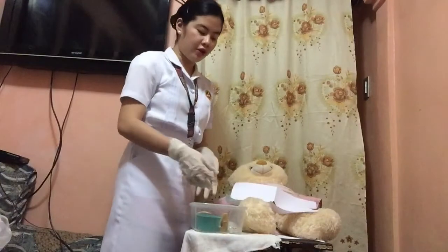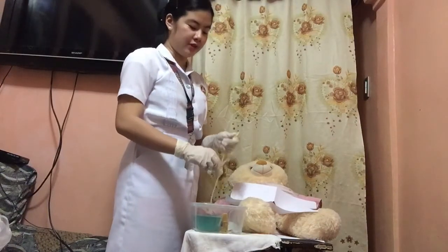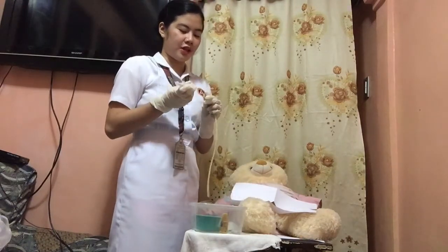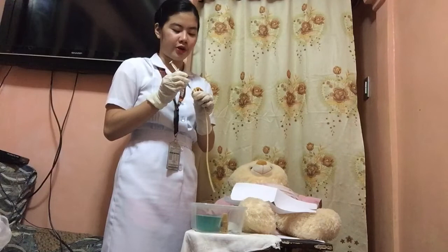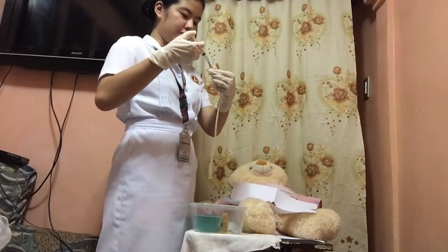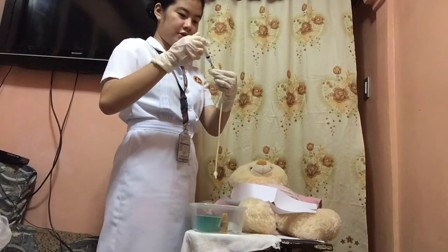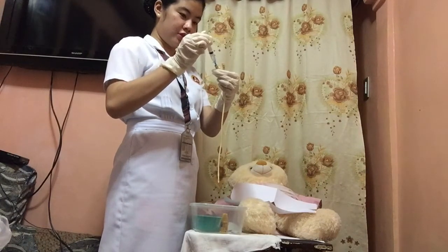Open all supplies. If the catheter is to be indwelling, test the catheter balloon: remove the cap on the tip of the syringe, attach the syringe pre-filled with sterile water to the injection port, and inject the appropriate amount of fluid. If the balloon inflates, withdraw the fluid and leave the syringe in the injection port.